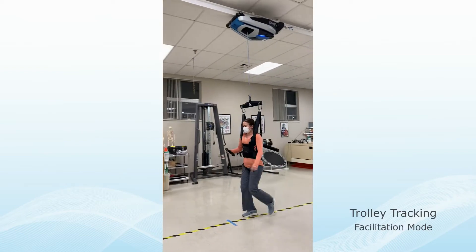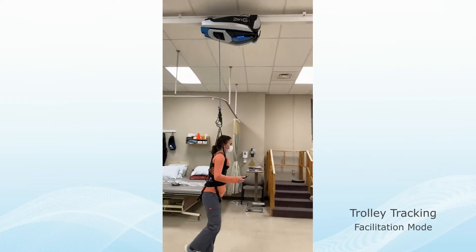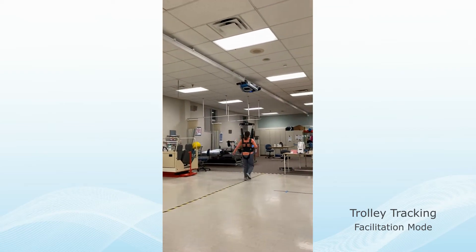In Facilitation Mode, the Zero-G robot is positioned anterior to the subject. The clinician can customize the level of pulling force to initiate gait or cue stepping patterns.